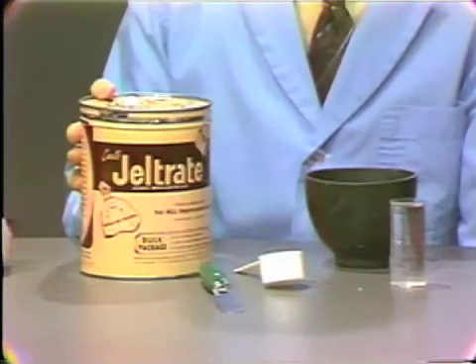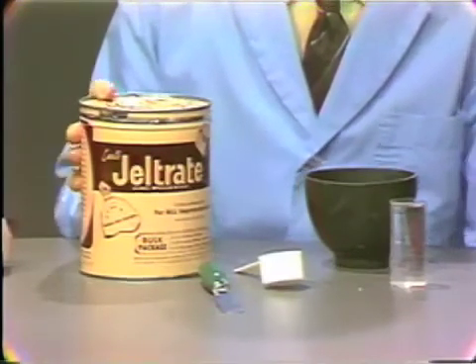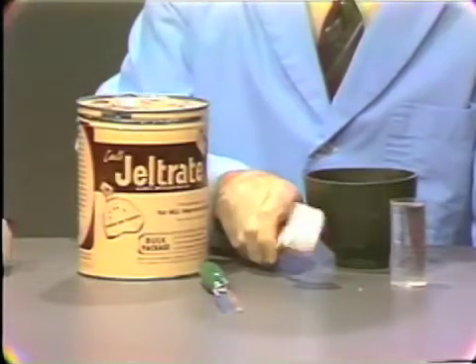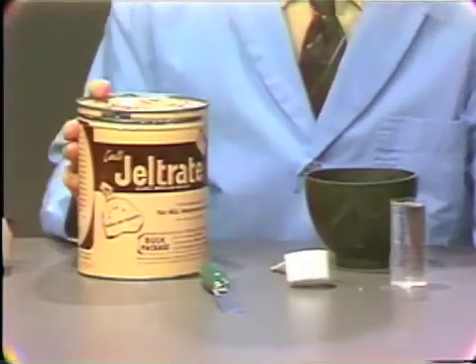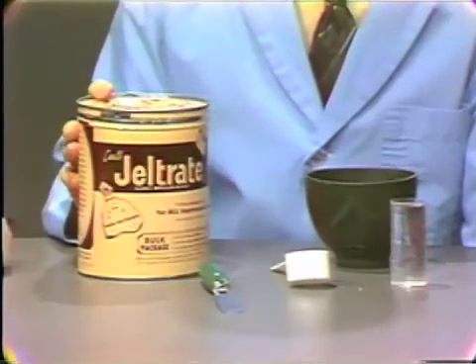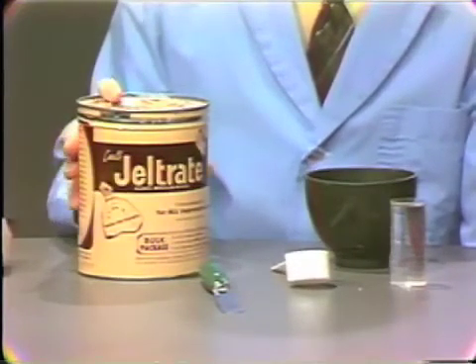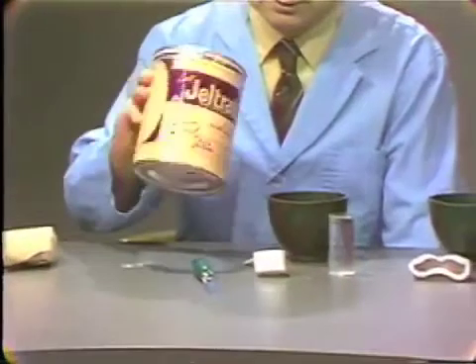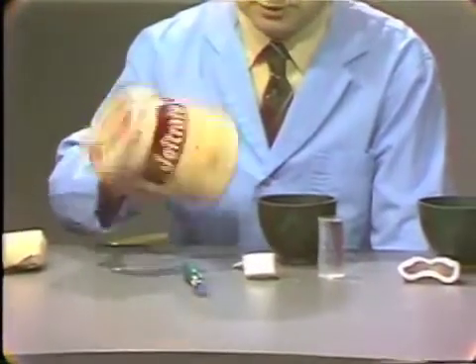What I would like to demonstrate is simply the mixing of alginate with water. The dispensing of the powder is done with this small cup. In order to be sure that you get the same amount of powder each time, the can of Jeltrate should be aerated, so it should be turned over several times before using this powder dispenser.